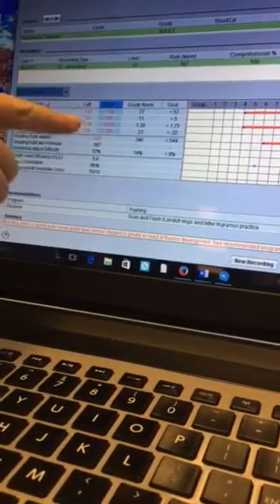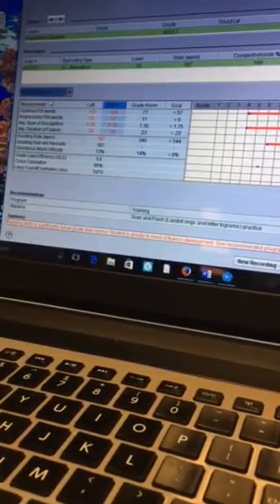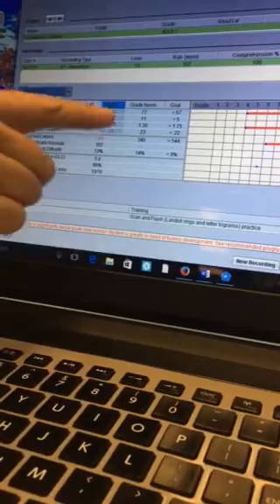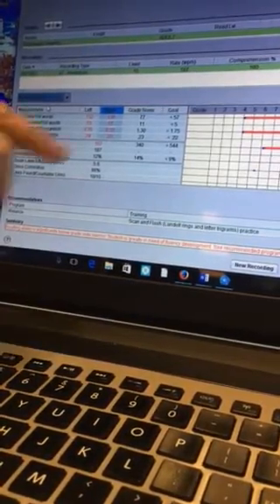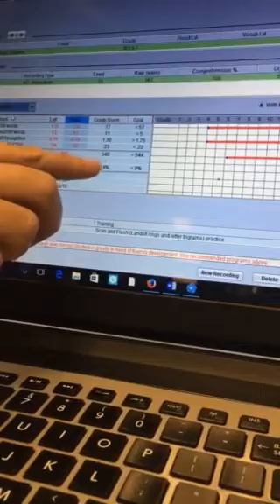I'm also seeing the number of times the eyes go backwards. We do a regression at the end of each line. Those are expected. These are the regressions above and beyond the backward movement just for moving to the next line. So again, I'm seeing a difference between left and right, and there's more back and forth than what there should be. So those are some of the key things. Overall, the reading rate grade appropriate for your son is 340 words per minute, and your son is testing at 187 words per minute.